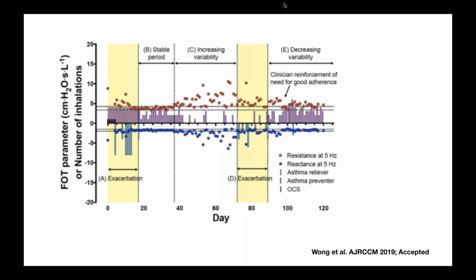So they've now started varying outside the limits of what we would deem to be normal for that person. Those happen to relate to a pending exacerbation, which was due to the child stopping taking his inhaled corticosteroid. And then with restarting the treatment, you can see the change in resistance. So this really is another demonstration of proof of principle that this might work. And you can see the time scale is in many days.